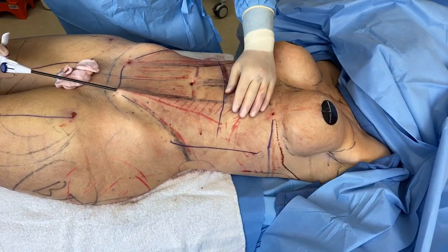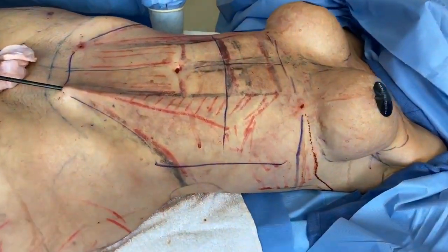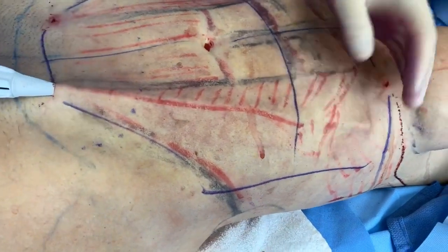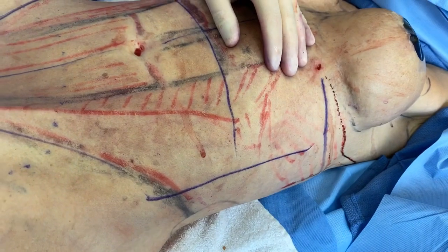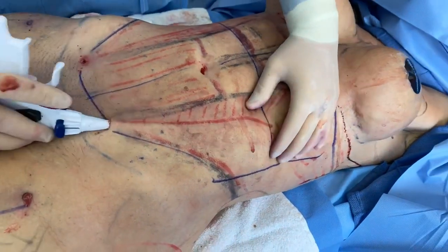Lots of passes are needed. You also have to have one major thing when you do this: patience. It takes time — go nice and slow. If you speed through this, the results are not the same.